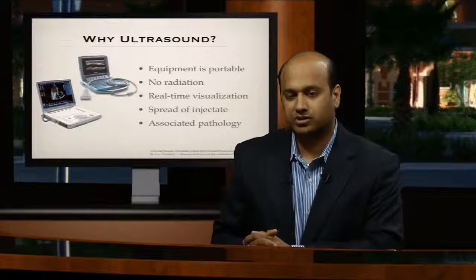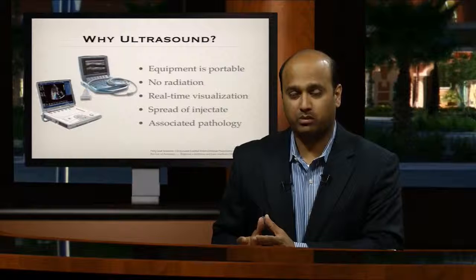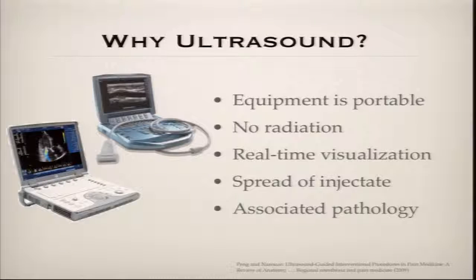Why ultrasound then? Well, ultrasound has now become a very portable piece of equipment. It's less expensive and it's user-friendly. There's no radiation with ultrasound, so we can use it in our patients and with ourselves without that risk over the long term. Ultrasound provides real-time visualization, just like fluoroscopy, but better than CT guidance, and allows us to see the variation in anatomy and pathology that we observe in our patients. When we're injecting medication, we can also see the spread of the injectate, which verifies the positioning of our needle, and it's very useful to confirm that final position before we do our injection.